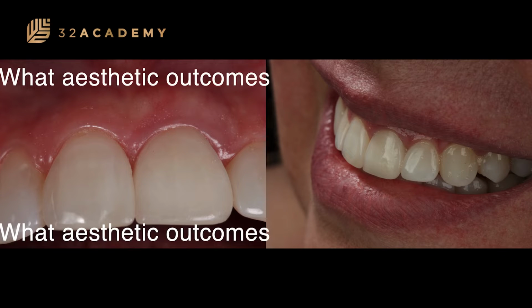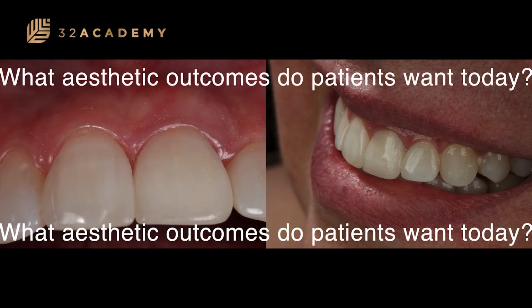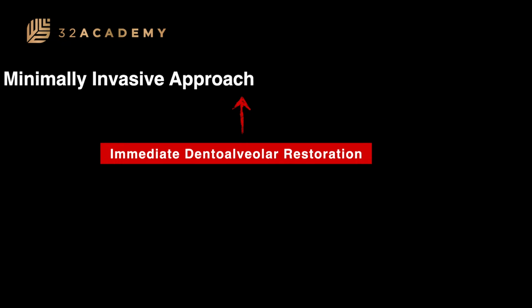So what aesthetic outcomes do patients want today? To mimic nature. If the patient lost the wall, our goal is to replace the wall that the patient lost with a new biological wall. That means we are going to use bone graft, a corticocancellous graft harvested from the maxillary tuberosity. This is the immediate dentoalveolar restoration concept.